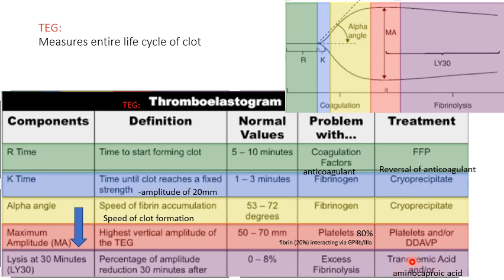It could be that a DIC patient may also have this type of problem. So it will depend upon the problem. According to the patient's case we can identify, and this will exactly tell you which product you should give.